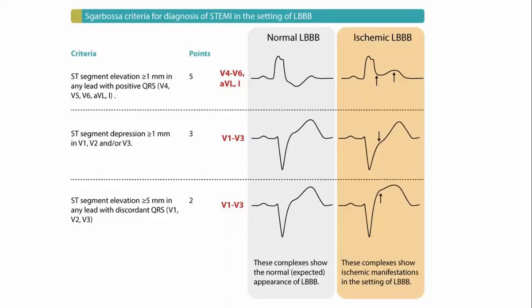So in other words, you've got a problem with conduction, and now you've just infarcted that. If you have a normal bundle branch block, that's one thing. But if you have a normal heart and now we have some damage to the heart, that would cause a bundle branch block too, if we've infarcted the heart and disrupted the bundle.